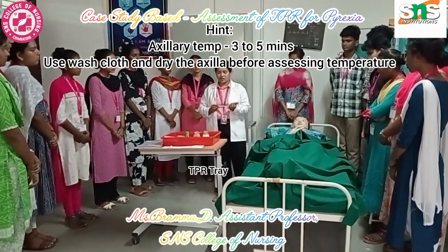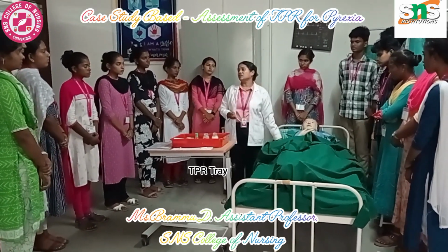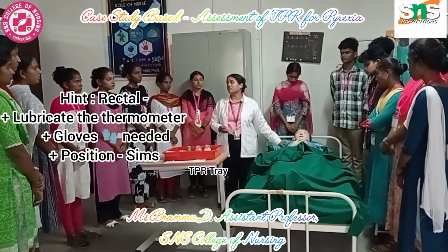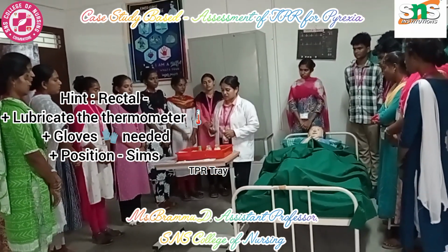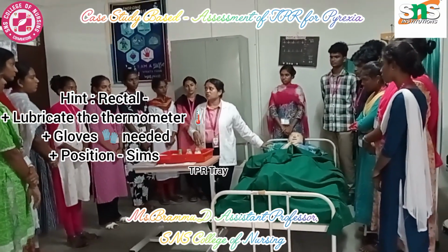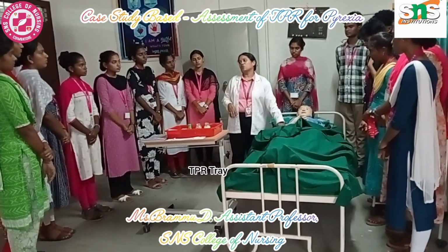The only thing you have to keep in mind when using axillary temperature is that you have to cleanse the axilla using a rag piece. If the patient is conscious, the patient will be able to do so. If not, we have to cleanse the axilla to dry the area, then you can put it onto the axillary region. If it is oral, it is 2 to 3 minutes contact time; for axilla 3 to 5 minutes; and for rectum it is 1 minute.